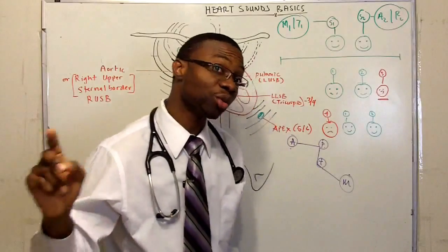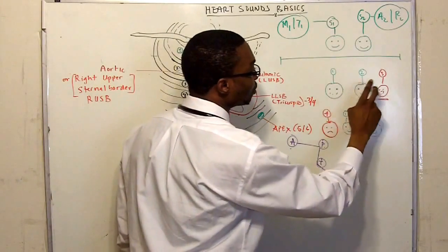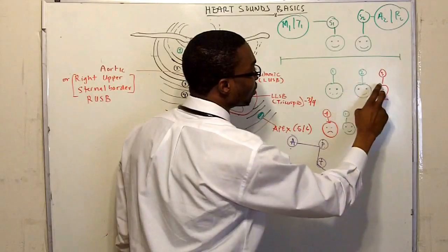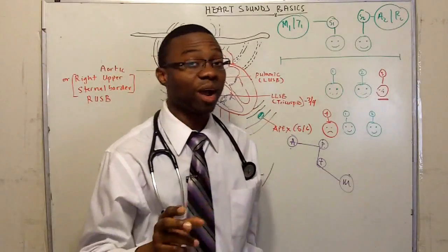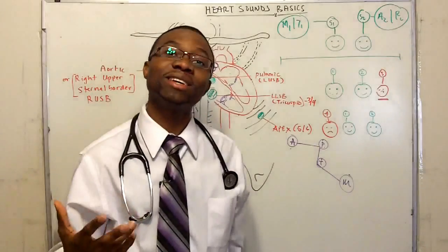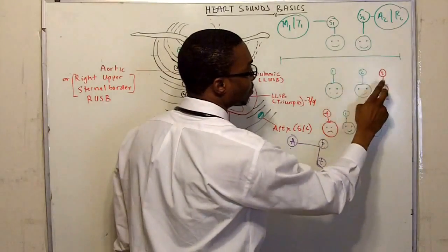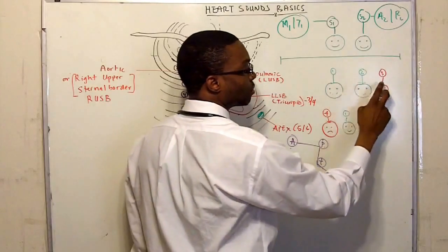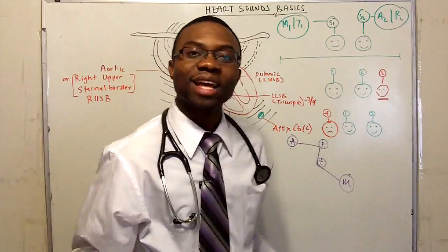That is 1, 2, 3. I'm already squeezing the smiley face, but it's not. It's fine. It's just an illustration. Now, I'm going to do it a little fast because when you're going to hear it, it's going to sound like this. Hear that? That is S3.